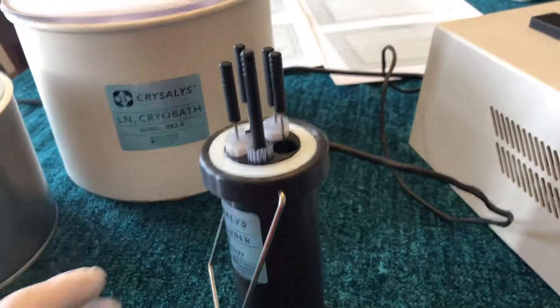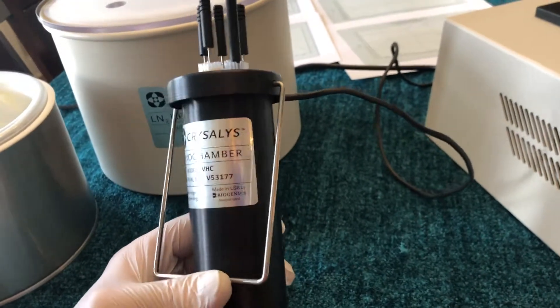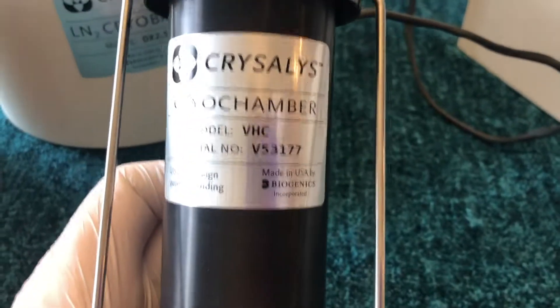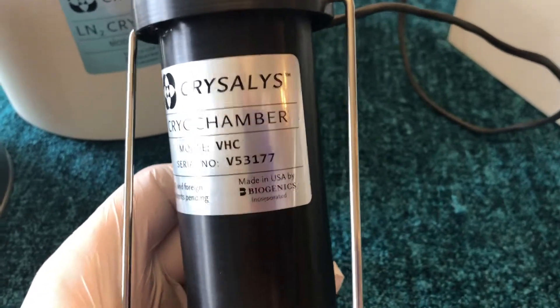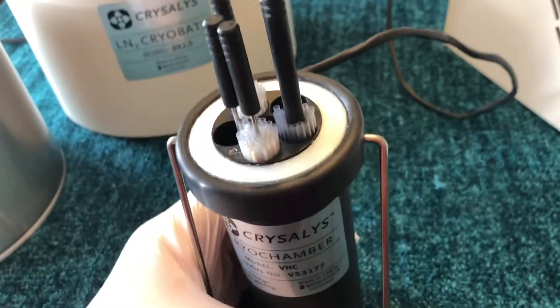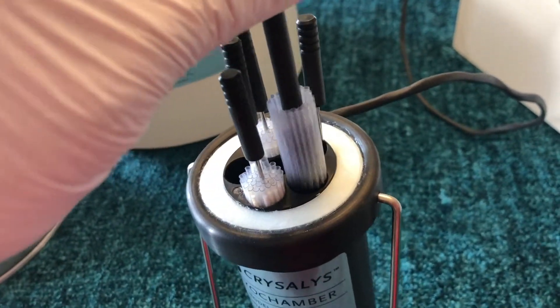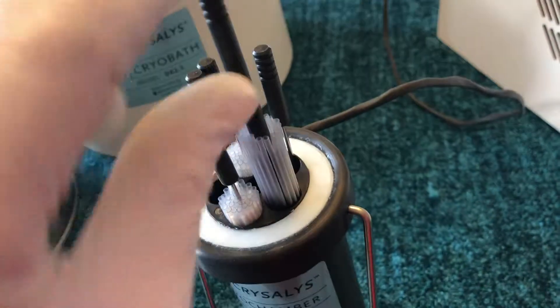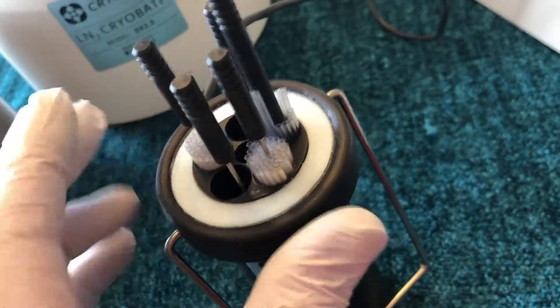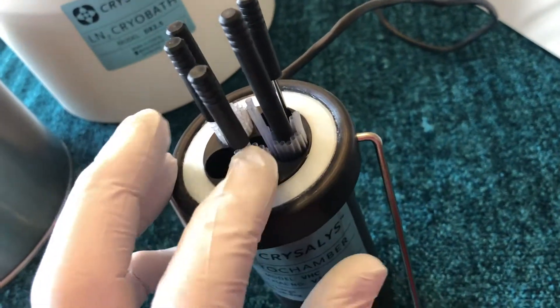Today we're talking about a different cryo chamber we produce, other than the standard straw chamber which holds 46 quarter ml straws for embryo freezing. This is called a VHC chamber — Variable High Capacity. This one chamber can accommodate cryovials on canes, half cc straws, or quarter cc straws, either in an annular configuration for embryos or in tightly grouped clusters, giving the chamber a 180 straw capacity when freezing semen for fast ramp applications.